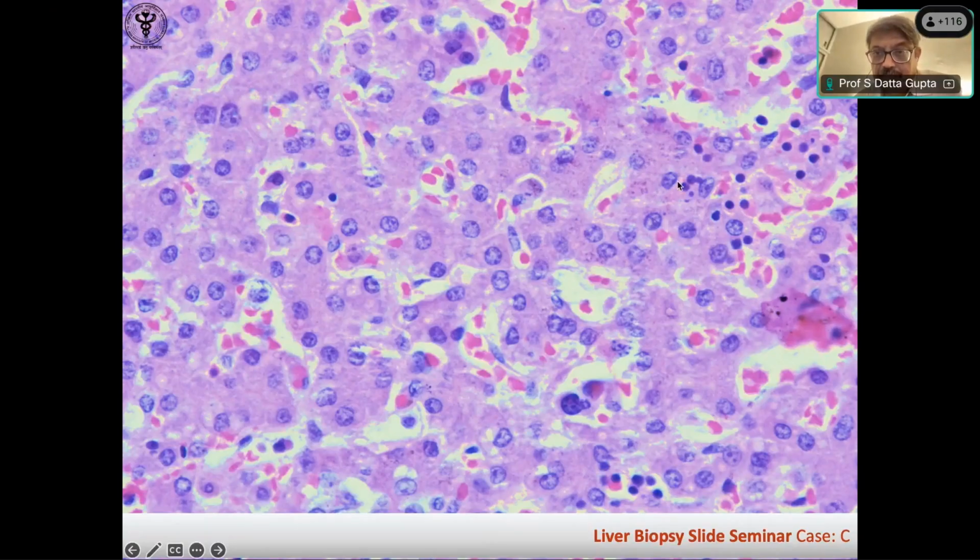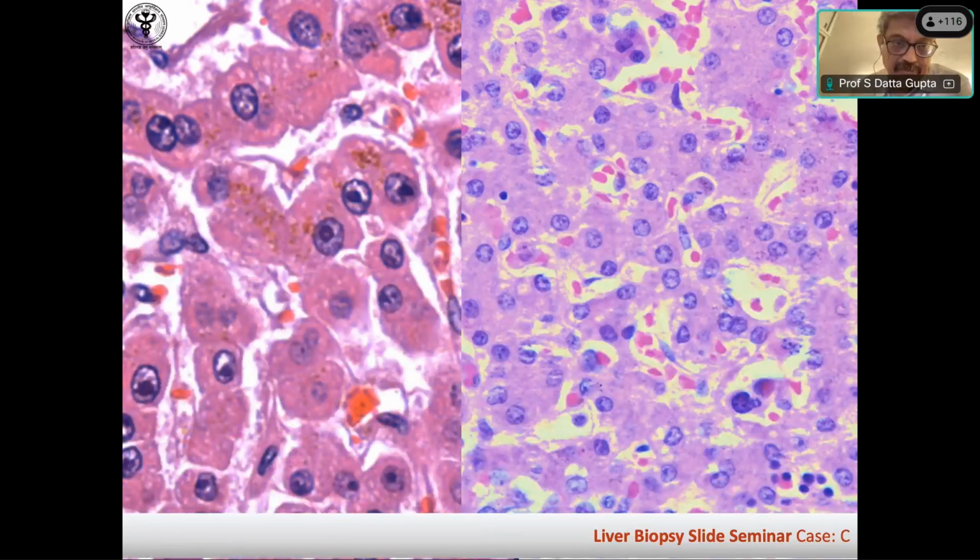Then you're finding a lot of NRBCs, plus this must be a megakaryocyte there. Right, and you see, they look almost like a pyknotic nucleus with this red cytoplasm all around, eosinophilic cytoplasm. And this nucleus looks almost pyknotic compared with the hepatocytes, and they are found in clusters. Very good.